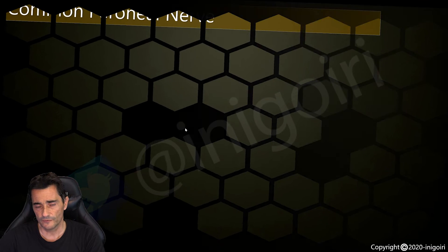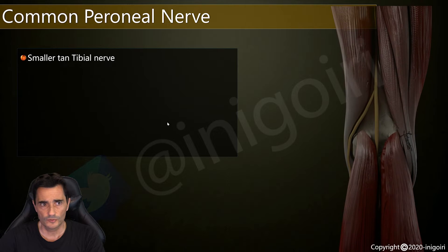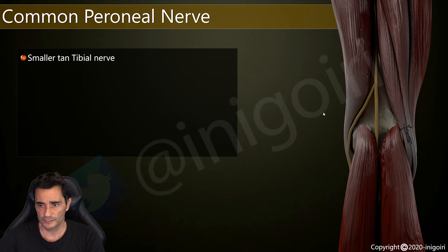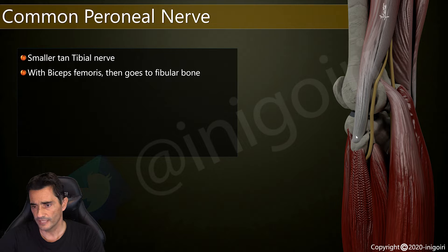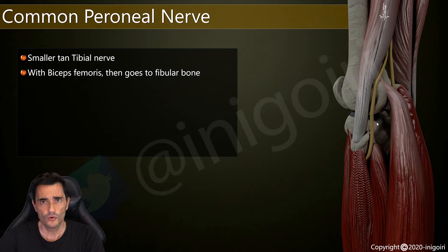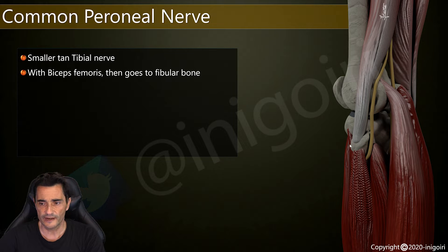The common peroneal nerve is smaller than the tibial nerve, always lateral and related with the biceps femoris. Notice how it becomes very lateral and superficial, running just under the skin. At this level, just reaching the head of the fibula, it becomes very vulnerable and easy to damage. So when you have a patient with symptoms of affection of this nerve, always examine this area carefully.